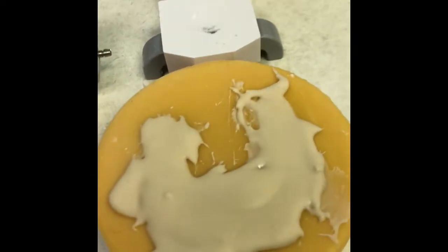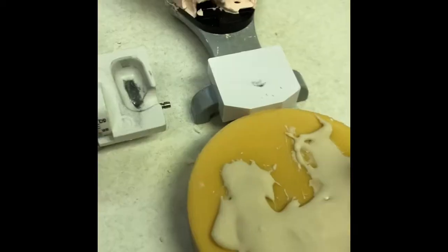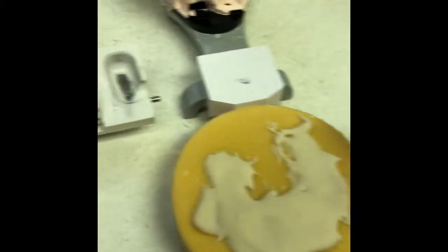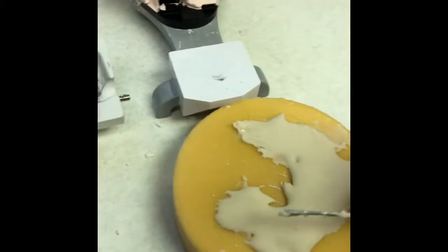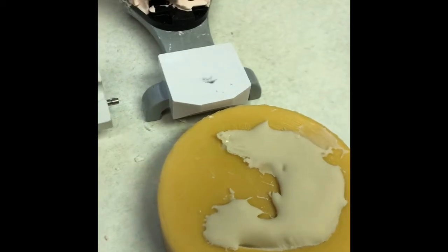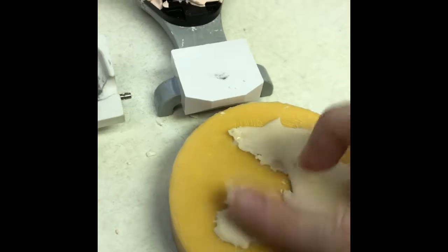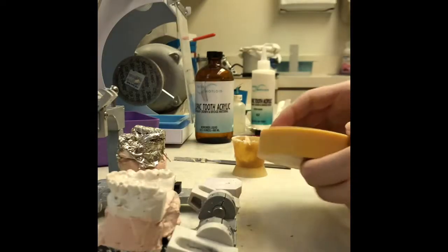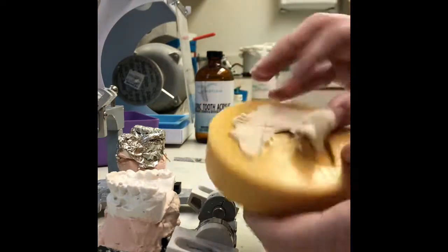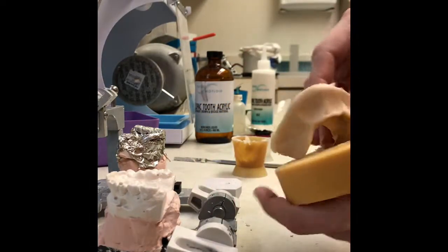So as it sets up, it'll start losing the stringiness. Now it's not so glossy on the surface. It's starting to get a matte finish there. It's only been about a minute since I actually put it in the former, and we'll see how this one turns out. Now it's starting to feel doughy. Okay, so as I peel this out of here, just kind of bending this, see how wrinkly it is. We can tell that that's ready to pull out because it's nice and wrinkly.